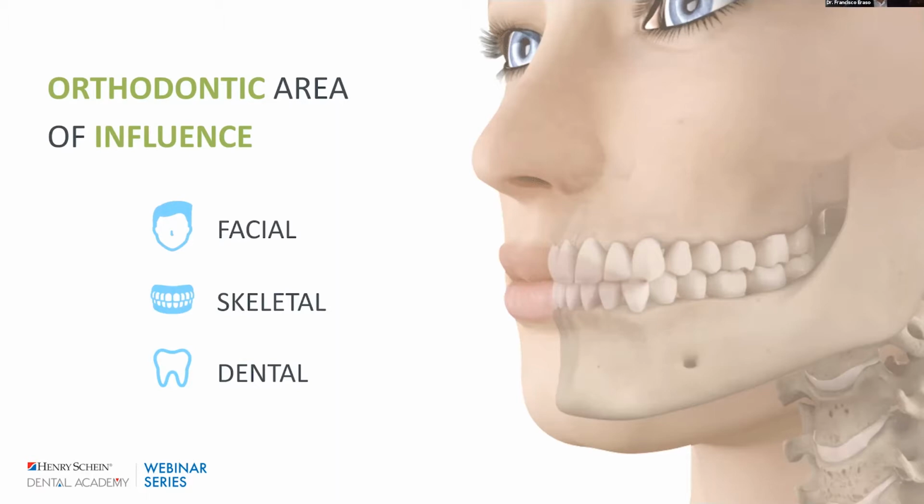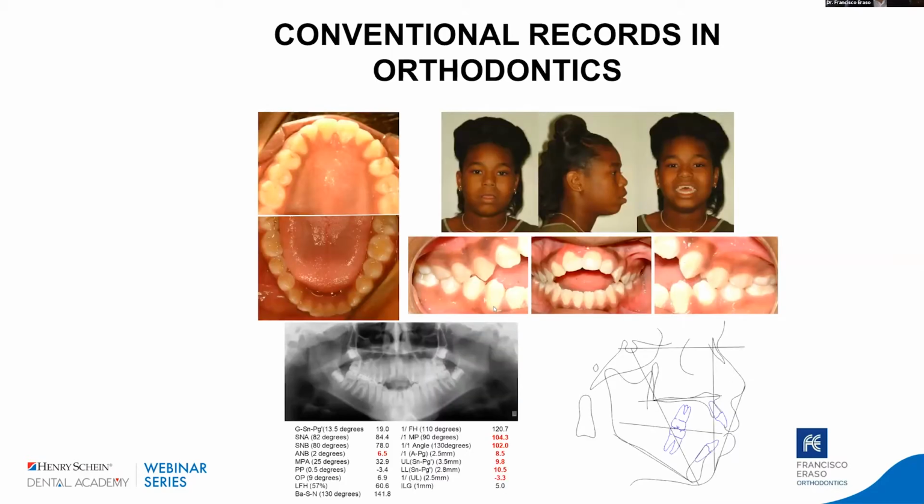So the idea for many people that the conventional orthodontic records can provide all of the information that we need is very naive, in my opinion.